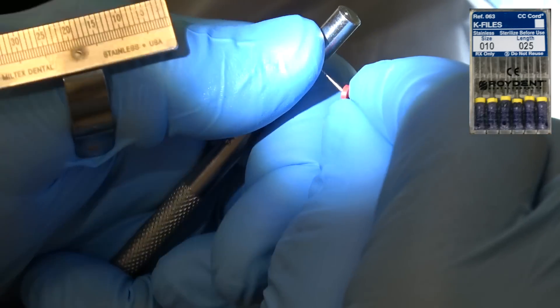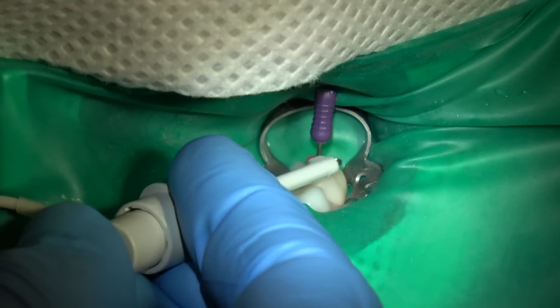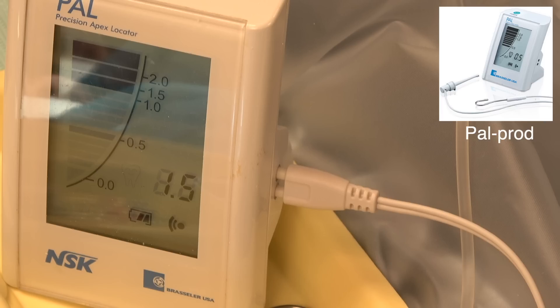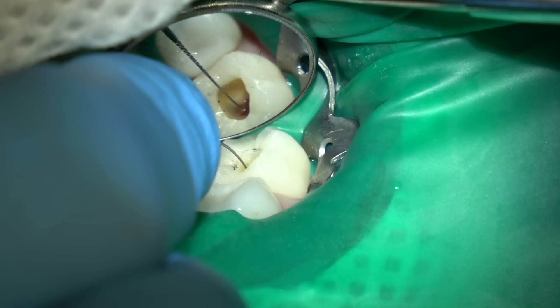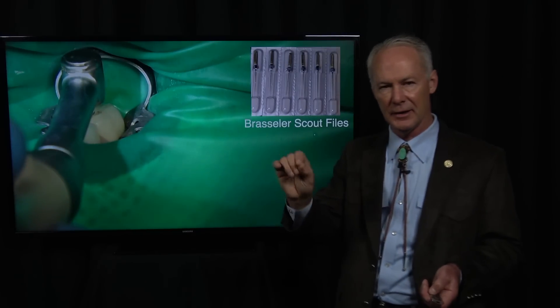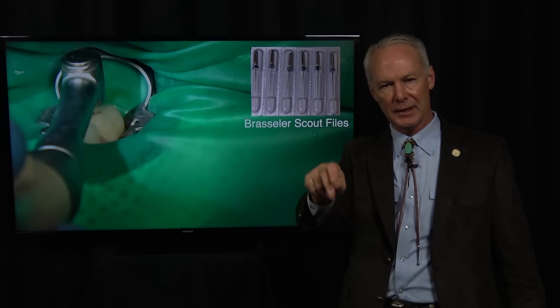Always curve the hand file prior to placing it in the canal. This is my apex locator — I'm 1.5 millimeters from the apex; you want to be 0.5, so I need to go about another millimeter. These are very accurate. What if you can't get a reading on that apex locator and it's all over the chart? There's probably fluid in the canal, so dry that out and put your hand file back in and take another reading.